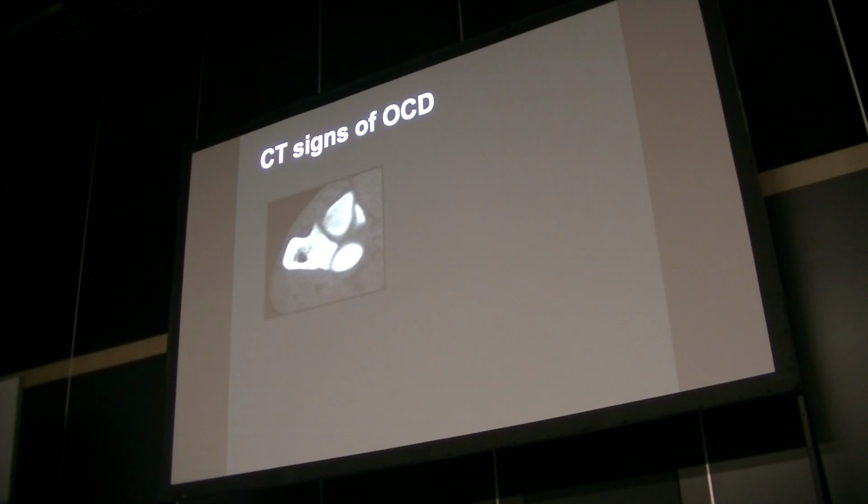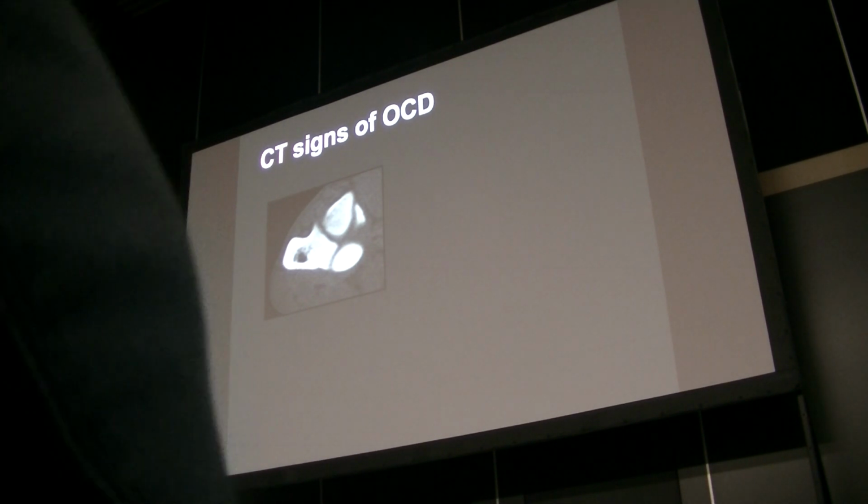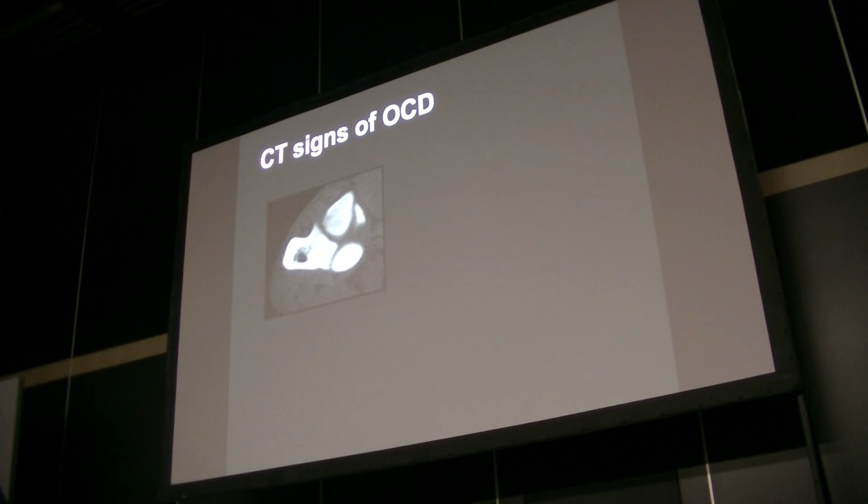Something about OCD. It might be difficult on the radiograph to pick up OCD. We need a craniocaudal view, which is necessary to pick up those lesions. And also it's important that we rotate a little bit, with an obliquity of 15 degrees, so that we really see the medial compartment of the elbow in order to visualize the delineation of the medial humeral condyle itself.